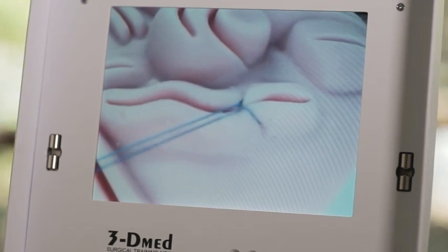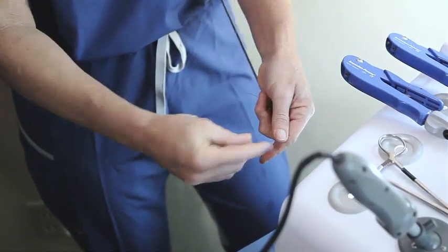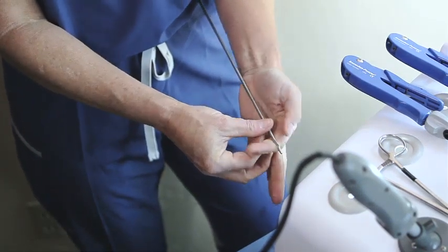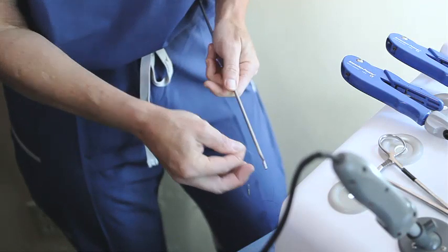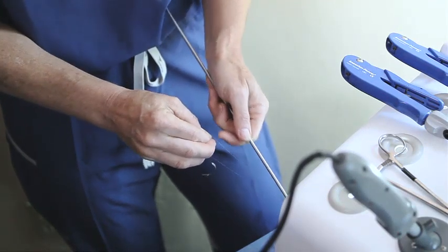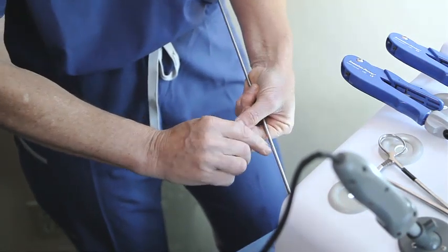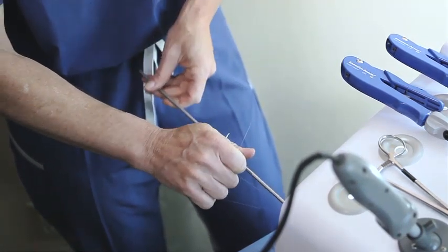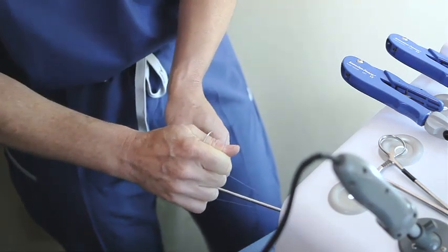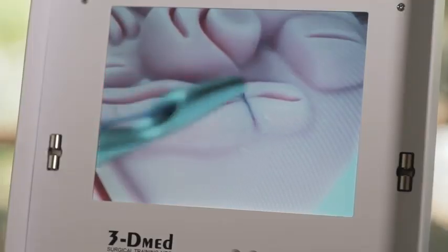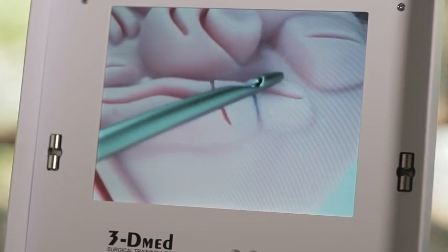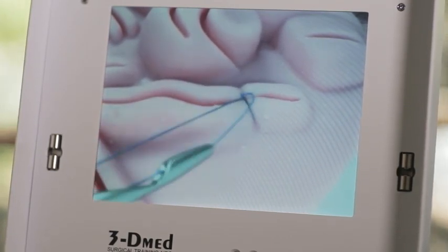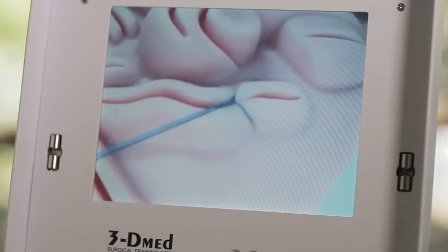For our last stitch, we will tie one more simple knot. I'll use both of my hands and this is perfectly legitimate too. You hold the suture as if it were like a marionette and you pass the knot down on the suture. And there we go. We tighten it using both hands. So that's three knots with an extracorporeal. Typically in surgery you will cut the needle off, but I left it on just for demonstration purposes.